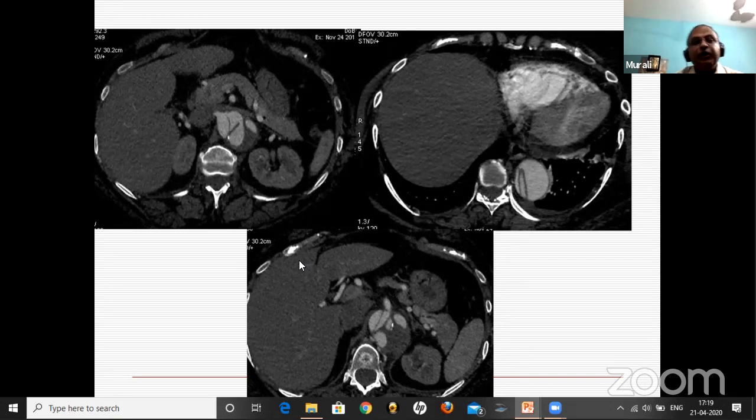It's very, very important you go through all the axial images very carefully, and make a mental picture of how the true lumen goes, how the false lumen goes. But what helps you in the cath lab is to have a transesophageal echo with a TE probe. Most of the anesthetists today, the cardiac anesthetists, are very good. They'll show you the wires perfectly, the true and the false lumen, in addition to fluoroscopy.